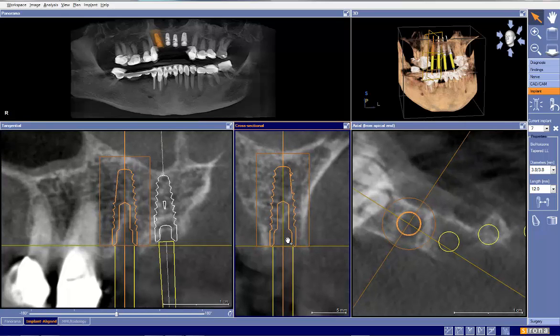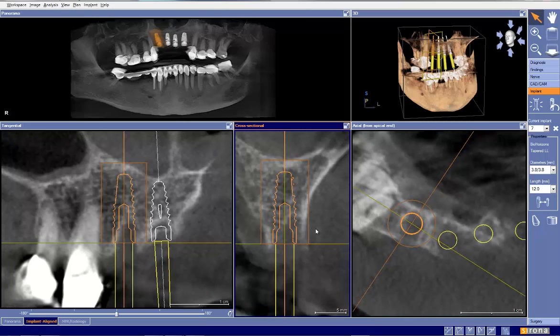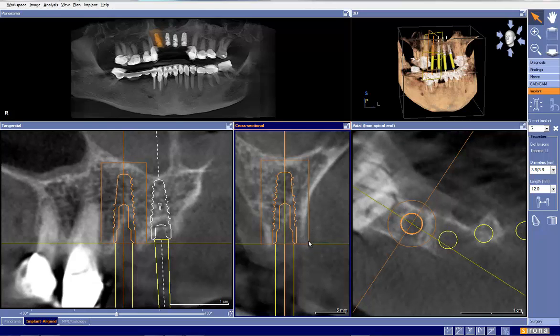Bone level position will be very much dependent upon where the bone site heals to. Looks like there's an extraction socket here. And also based on where we want our final gingival margins to be. I'll go and say that based on the plan that you had, we were definitely at crestal level or slightly subcrestal, which is my preference.